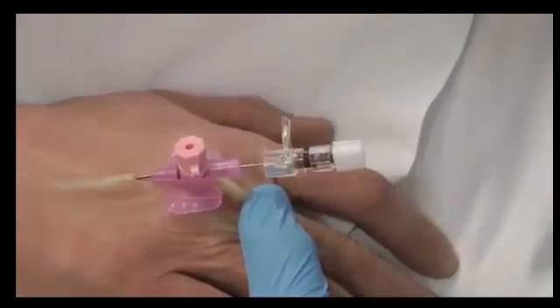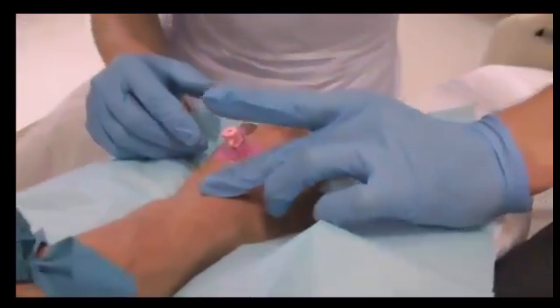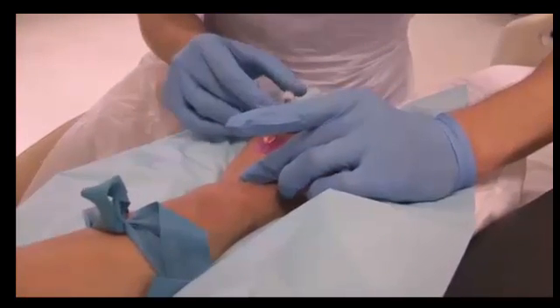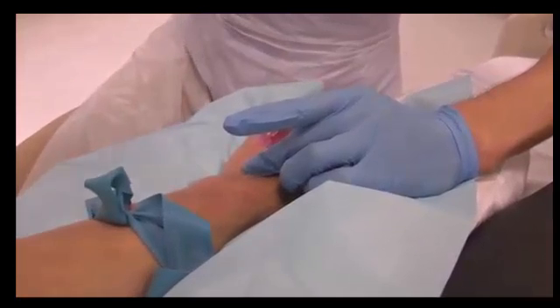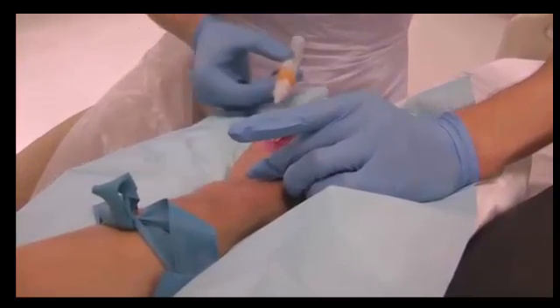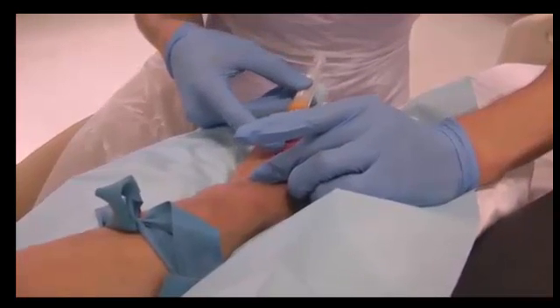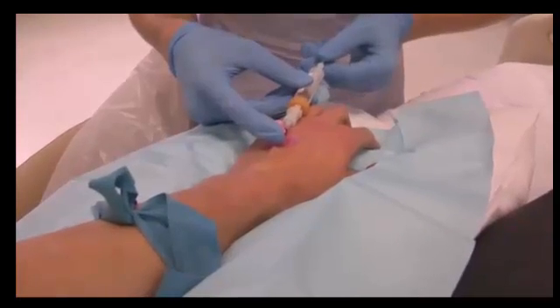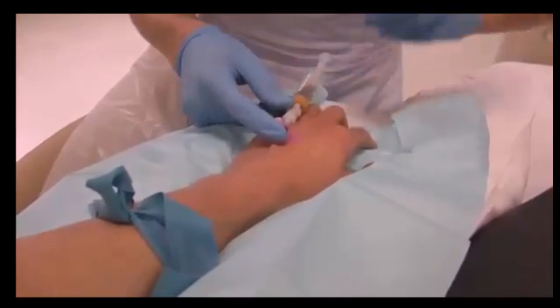Release the tourniquet if you do not plan to take blood. Securing the cannula with your hand, remove the needle completely and place in the sharps bin. When taking blood, occlude the vein with your middle finger and stabilise the cannula with your thumb or index finger. Attach the adapter and blood bottle to take the blood sample, making sure to stabilise the cannula. Aspirate the blood slowly, then release the tourniquet.